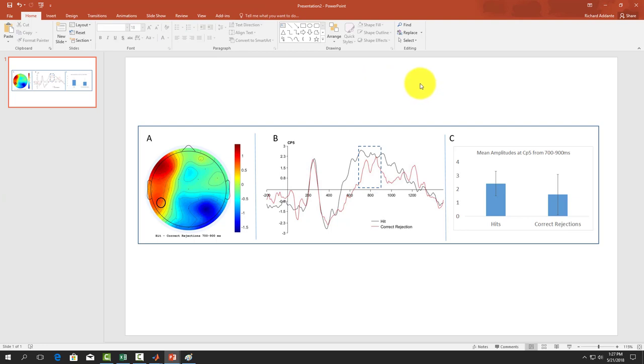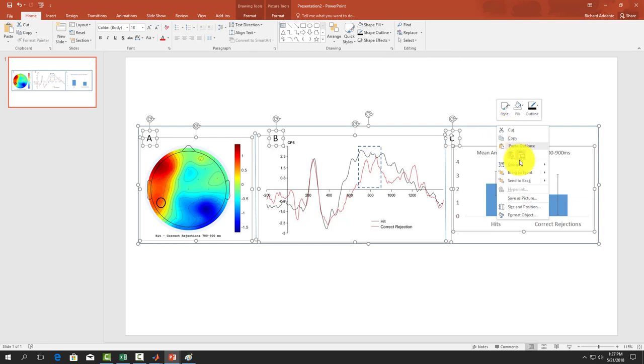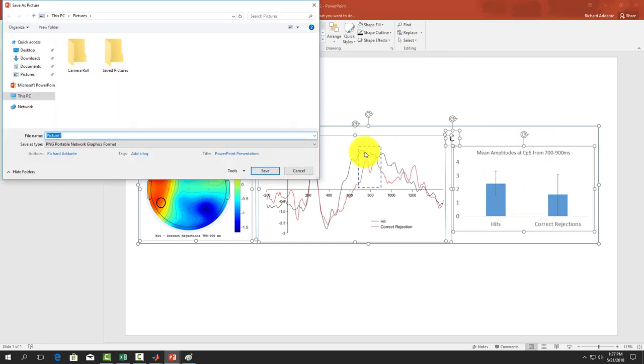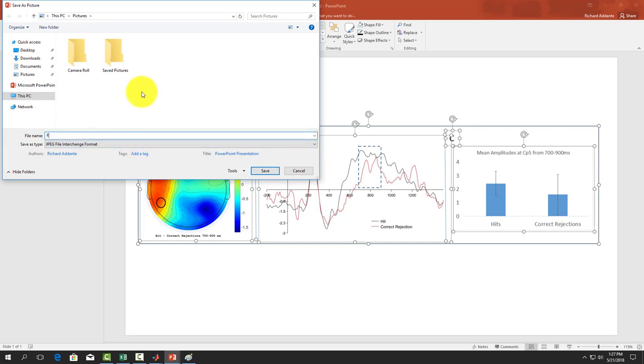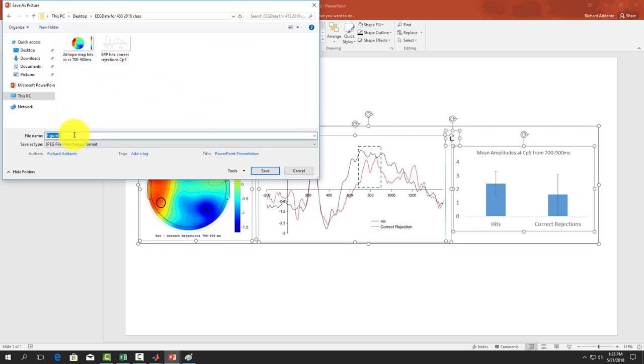Now let's say control A, which highlights everything. You right-click and it says save as picture. Let's change our format to a JPEG and let's call this figure 2. Usually figure 1 is going to be the figure in the paper of your paradigm. Let's just call that figure 2, hits versus correct rejections, 700 to 900 milliseconds.